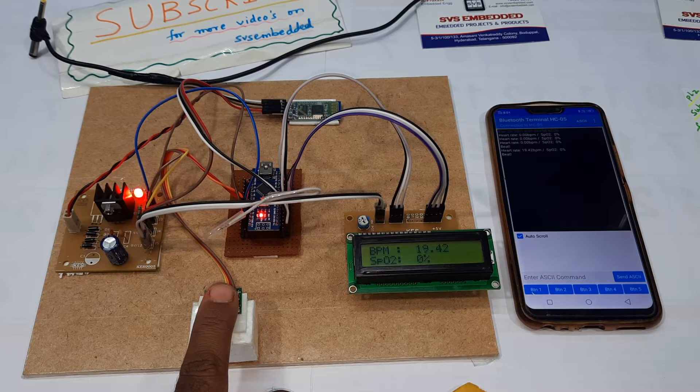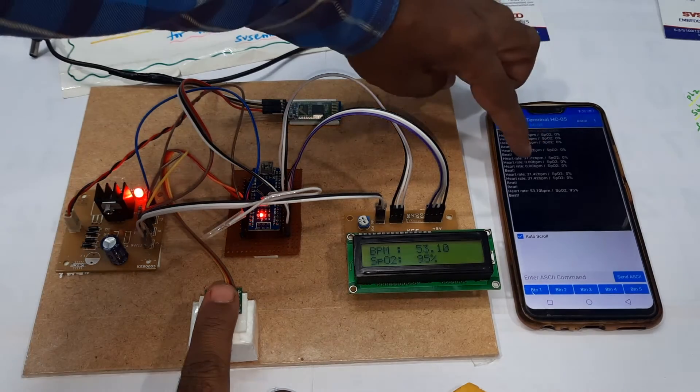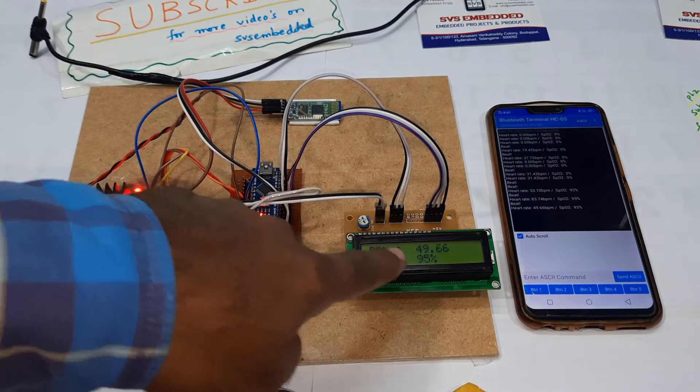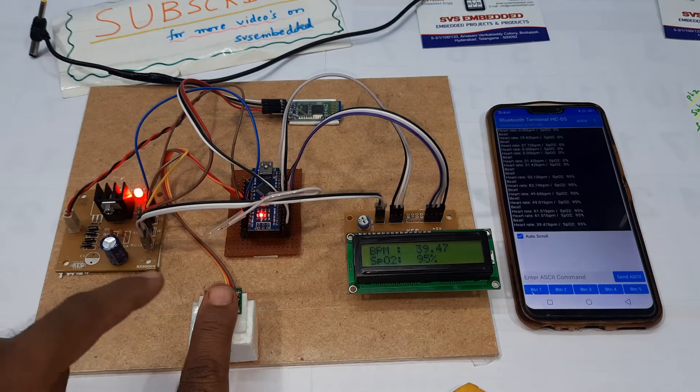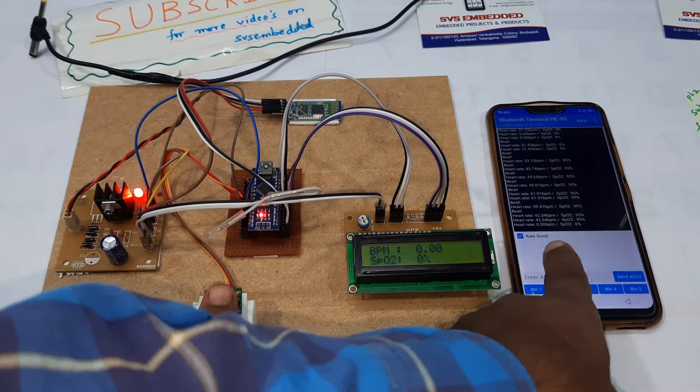Now via Bluetooth we are getting readings — SpO2 95, heart rate 83, SpO2 95. You need to connect your finger properly onto the MAX30102 sensor for the values to come in accurately.